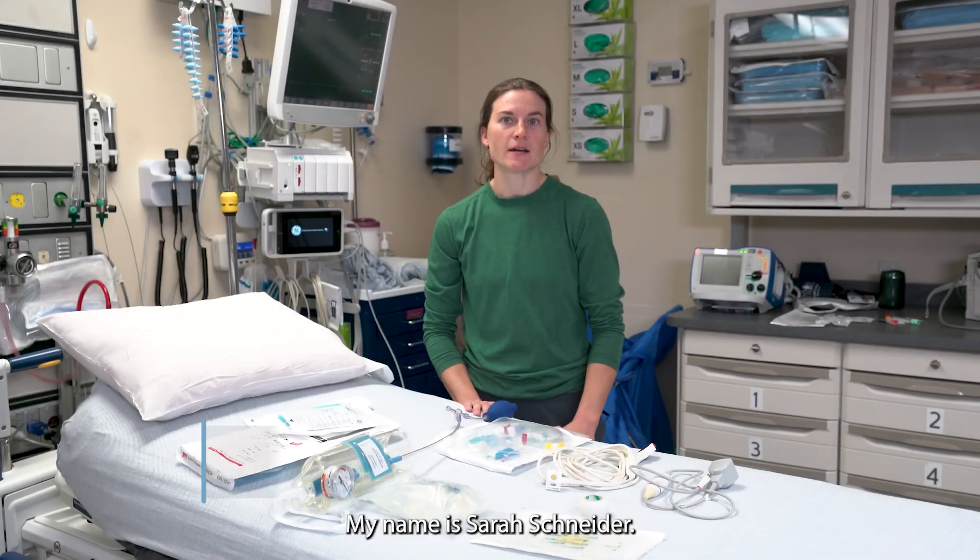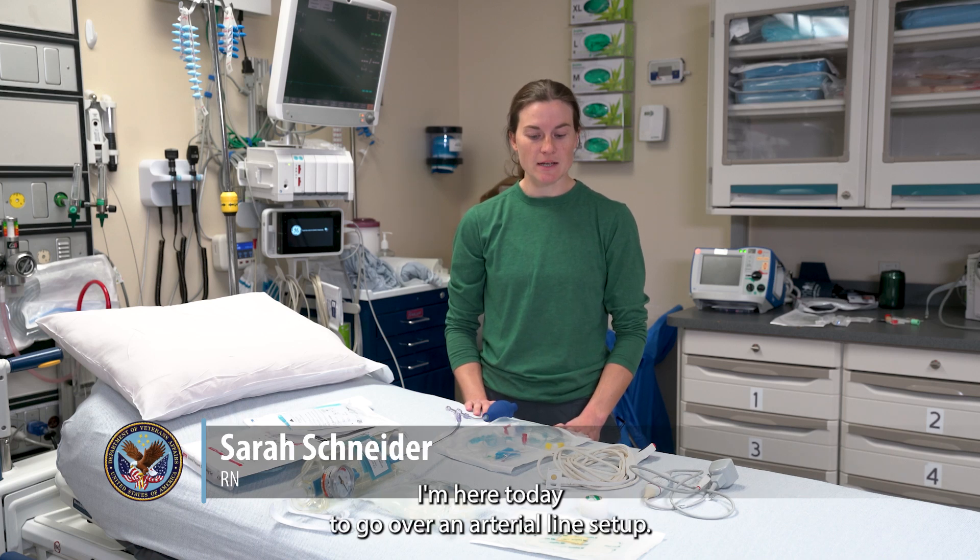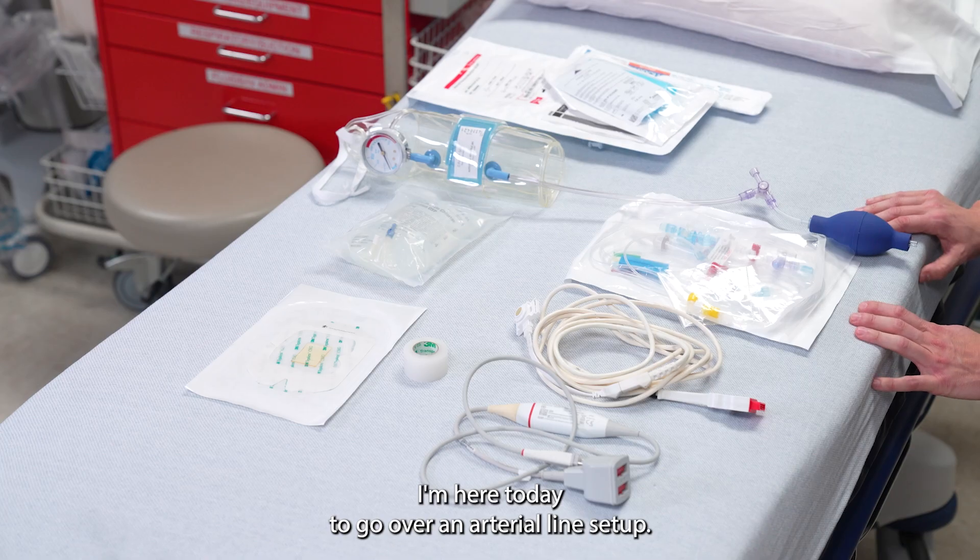Hello, my name is Sarah Schneider. I am a nurse in the emergency department here. I'm here today to go over an arterial line setup.